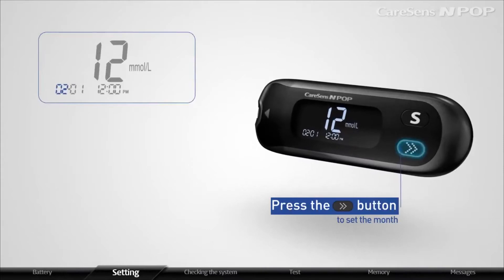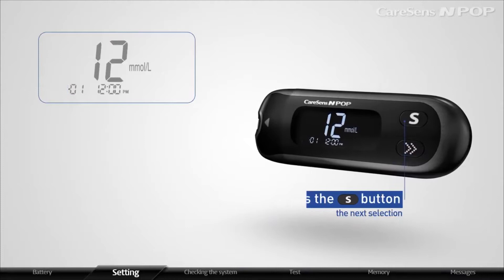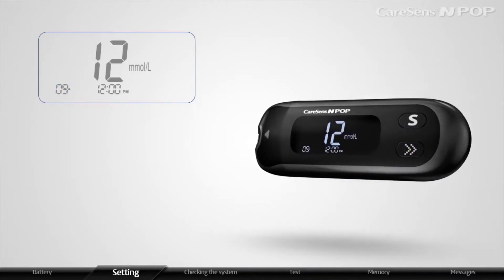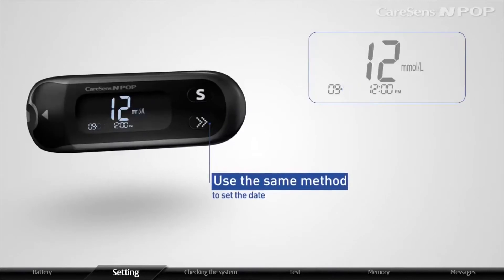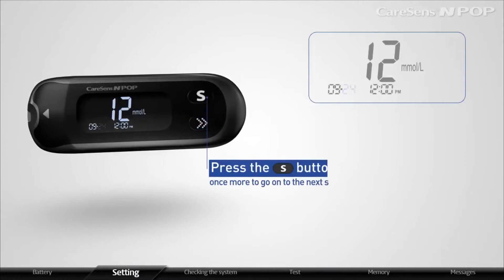When the number indicating the month blinks, press the arrow button to set the month. When the month is properly set, press the S button to go on to the next selection. Use the same method to set the date and press the S button once more to go on to the next selection.